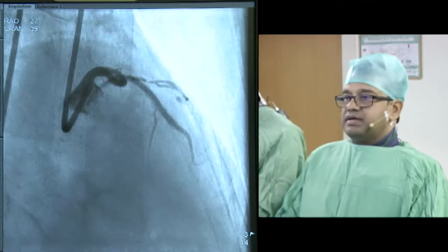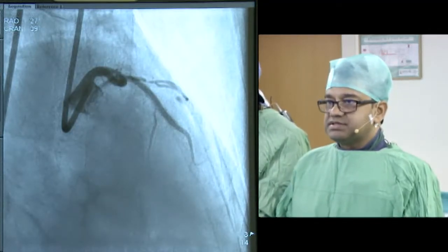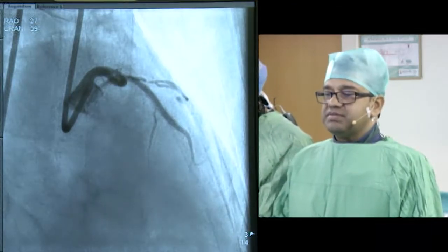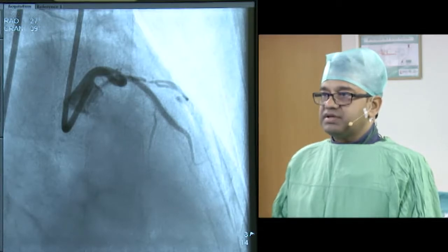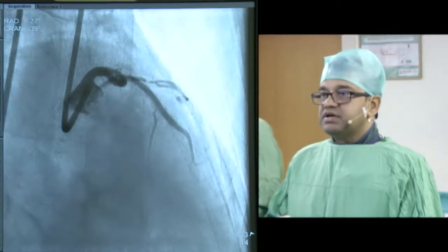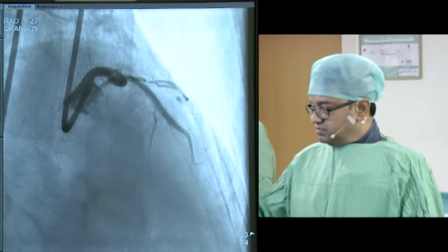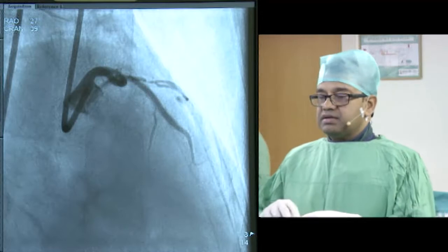So we felt that we would fix the distal circ first, and we had information from stress perfusion imaging that both the LAD territory and the posterior wall had reversible ischemia. So we had committed to treat the proximal LAD lesion and the circumflex distal. We have just wired the distal circumflex, and we wanted to do the distal circ.